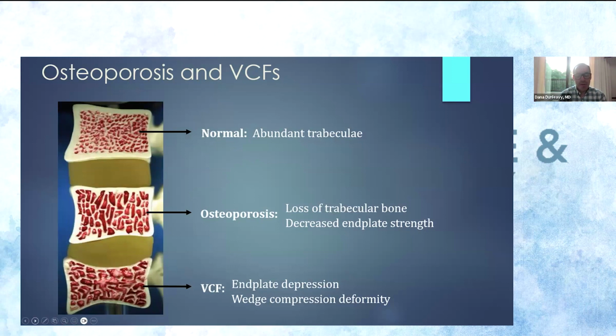And today was a classic example for me, actually: a 94-year-old retired physician. And you just don't have the same tactile feedback because he had such extensive osteoporosis that the cannula just kind of floats through the pedicle into the vertebral body, and that can be even more challenging.